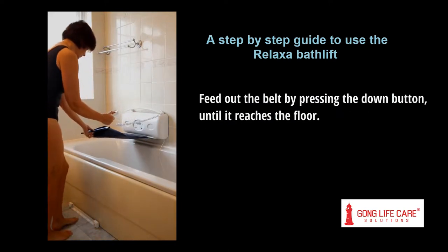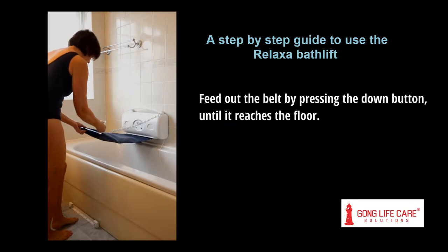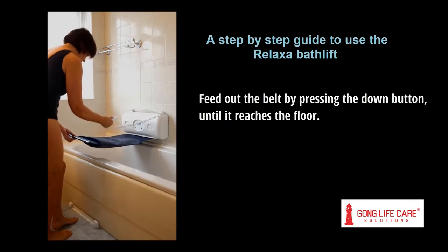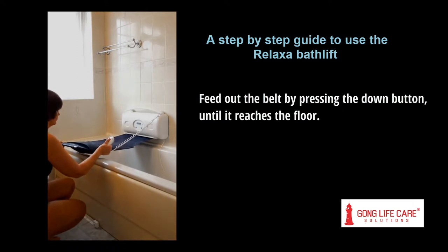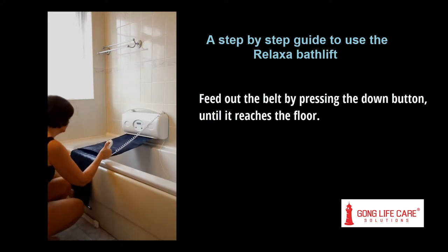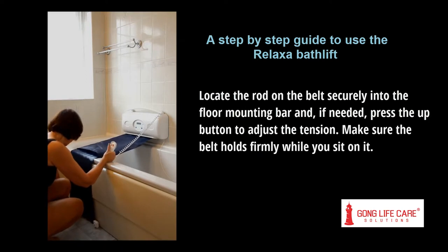Feed out the belt by pressing the down button until it reaches the floor. Locate the rod on the belt securely into the floor mounting bar and, if needed, press the up button to adjust the tension.